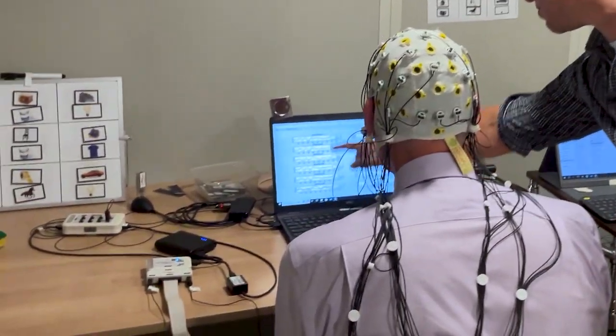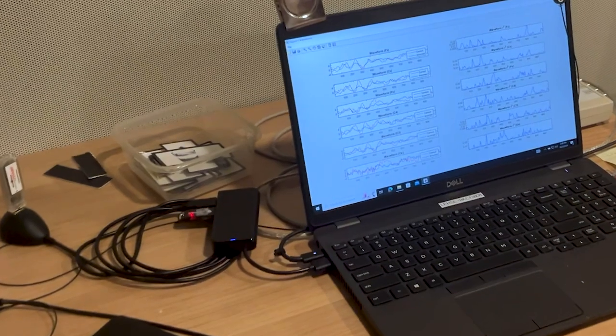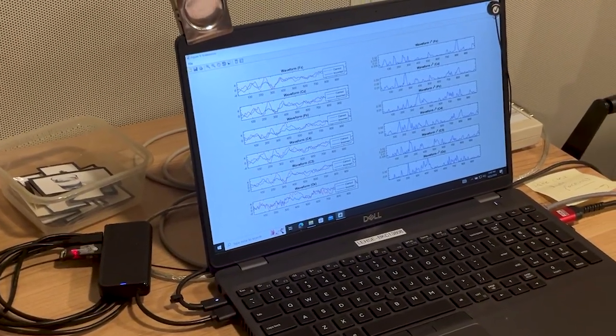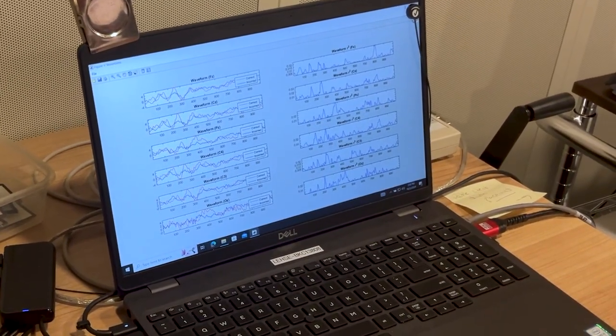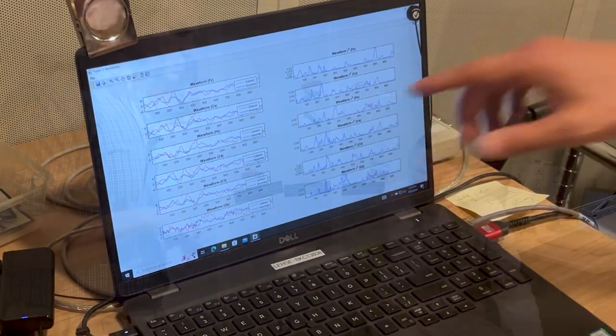What we're really interested in is this thing over here. The red line you're looking at is basically that P300. So that's the brain activity that was happening when you were looking at that specific target. The blue line is what your brain was doing while all the other things were flashing on the screen that you didn't care about. So all those other items flashing.